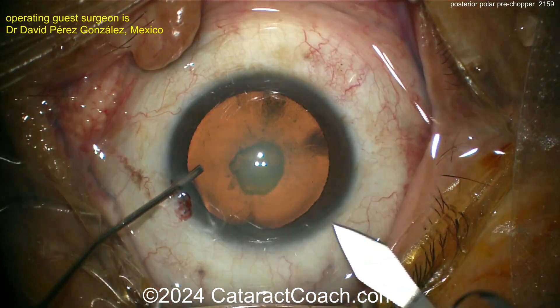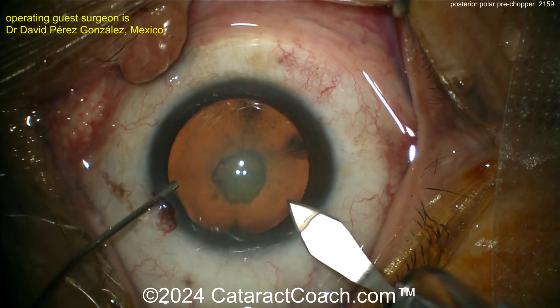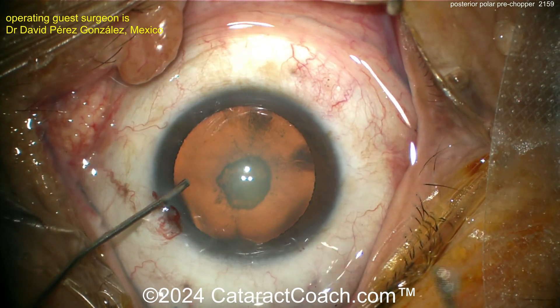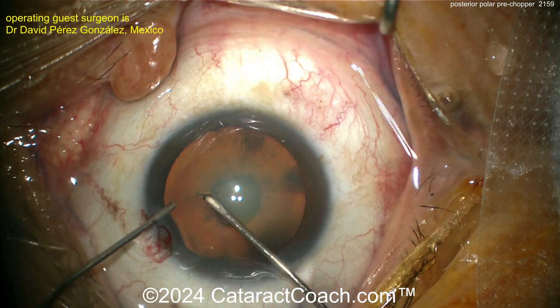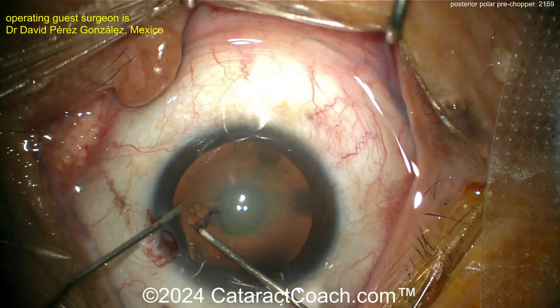You may end up putting in a sulcus lens with optic capture, so having a nice five-millimeter rhexis is really key. Now there's the incision — looks pretty good. Here comes the instrument getting that rhexis done, and you want that beautiful five-millimeter rhexis.